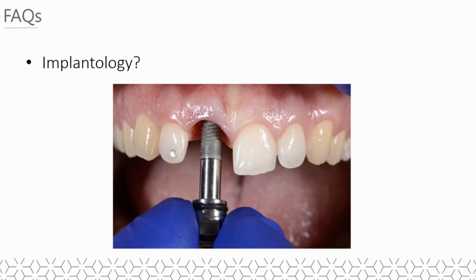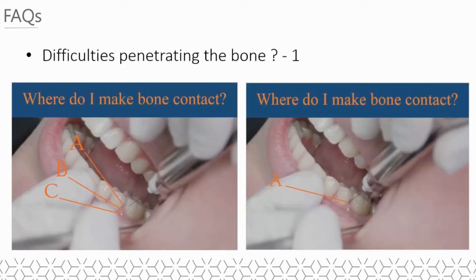Can we use intraosseous anesthesia with implantology? The intraosseous injection provides immediate anesthesia of the attached gingiva and the cancellous bone, making it the ideal approach for short, flapless implant treatments, or those involving minimal flaps with attached gingiva. But QuickSleeper can also deliver an infiltration necessary when a flap is required. So yes, it is completely possible to use intraosseous anesthesia and QuickSleeper for implantology.